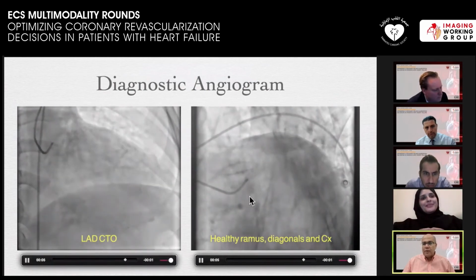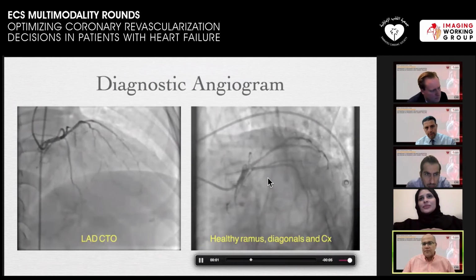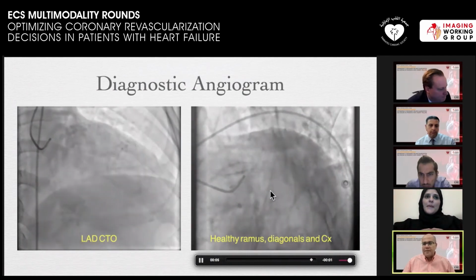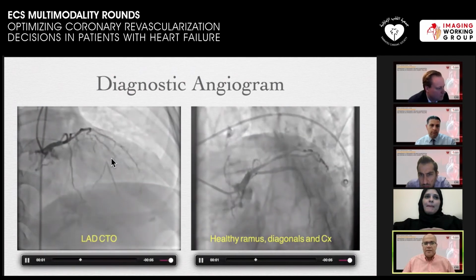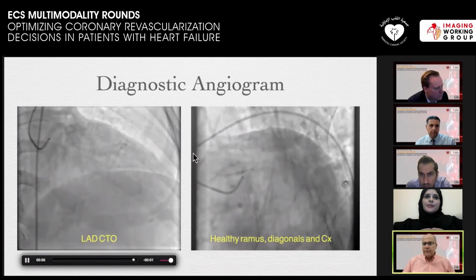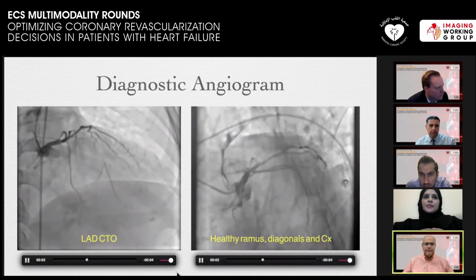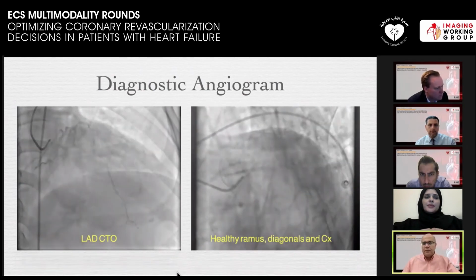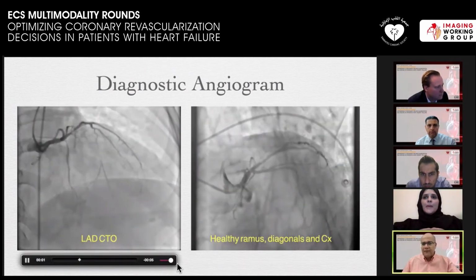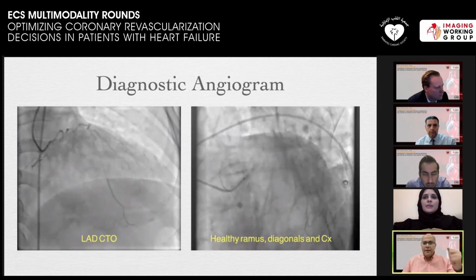There is a total occlusion of the proximal LAD with a very ambiguous cap with branches coming at the stump of the occlusion. And we see that the mid and distal portions of the LAD are filling via collaterals from the left coronary. So we thought that this LAD is the one in which he sustained the infarction 10 years earlier.